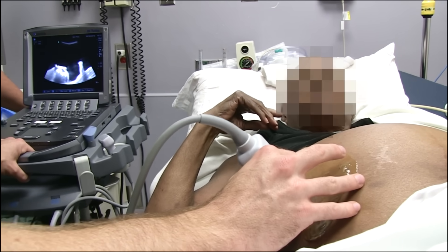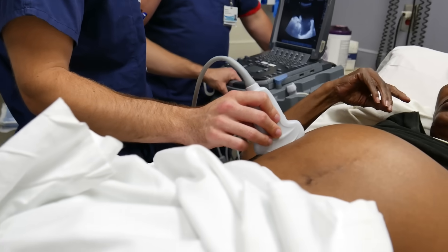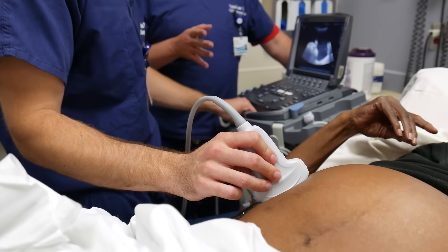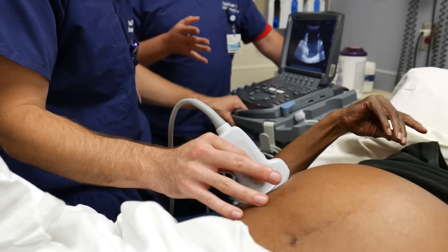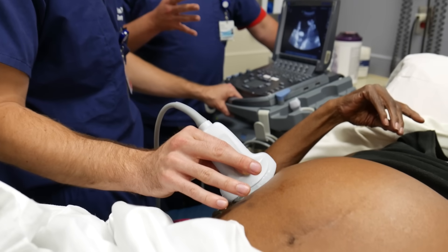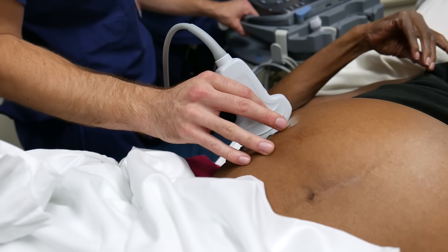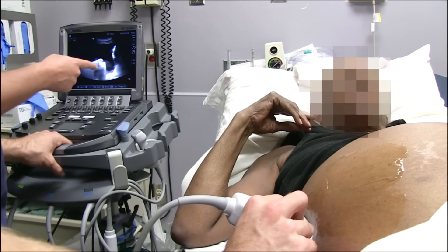You want a pocket that doesn't have any solid organ or bowel close to the peritoneum. You need a pocket to stick the needle in at the most dependent location possible, because if you just drain the top you're going to get below your catheter. So you want to come as far down lateral as you can — like a sagittal cut, almost like a FAST exam.